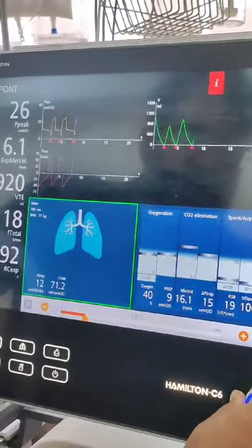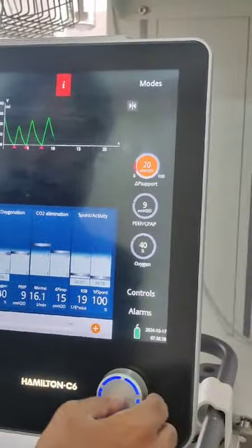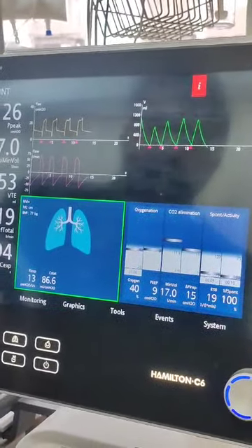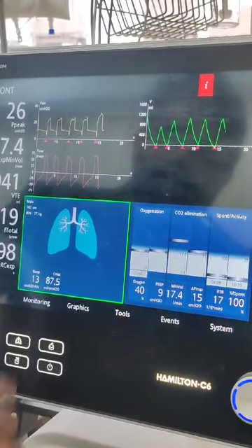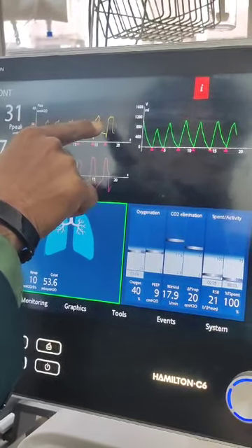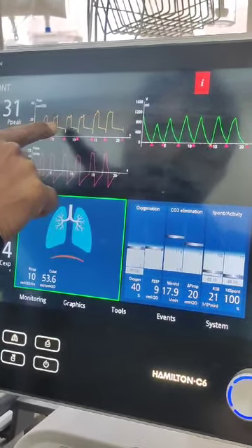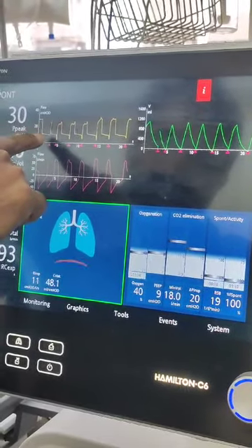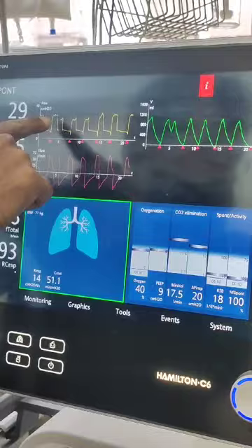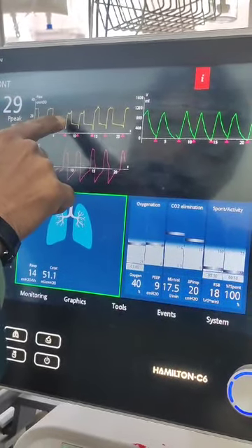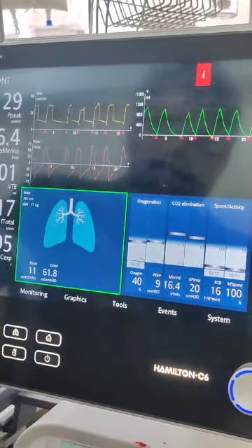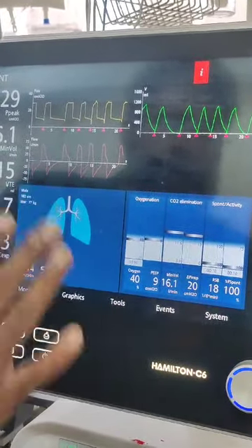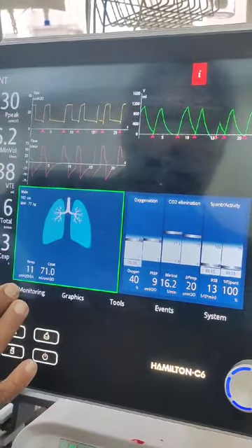It probably needs more support. Let me make it 20 — it's a very high support, but it's a very big gentleman, so maybe he'll require higher pressure support too. The tracing is getting smoother. Now we just have one small blip in the centre, and even that is becoming flat. As we see, the entire pressure support blip has gone. It looks like I'm assisting well, though the tidal volumes are very high — but this is the assistance he's requiring to iron out the trace.